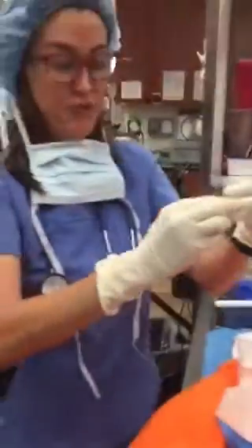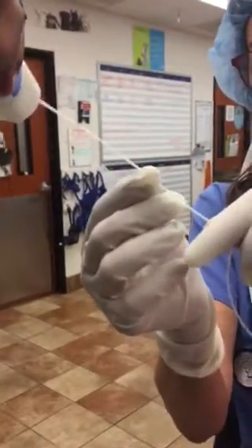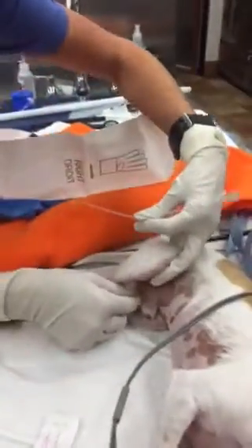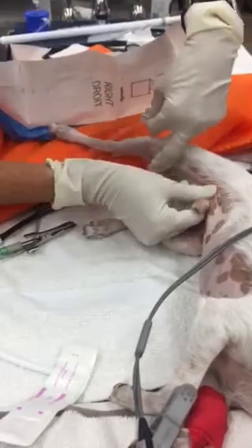I'm going to put sterile lube on the tip. Everything is sterile. Push up the prepuce.